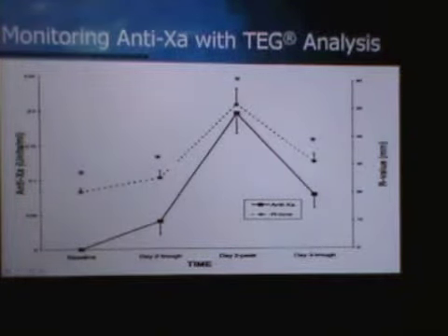Right. Or how about a Lovenox Coumadin bridging? How are you monitoring that? So you get an INR? INR's not going to show you Lovenox. No, we do Lovenox and we give Coumadin until the INR goes up and you stop Lovenox. That's what we do. Right? Yes, sir. Right? So they bleed to death.